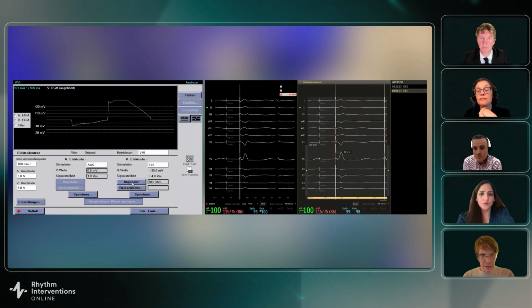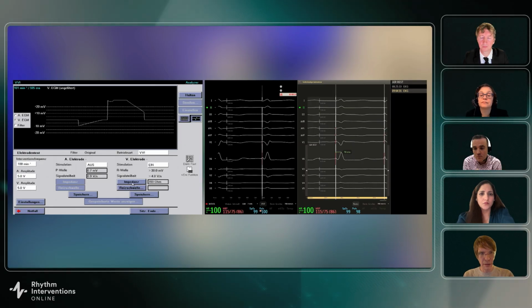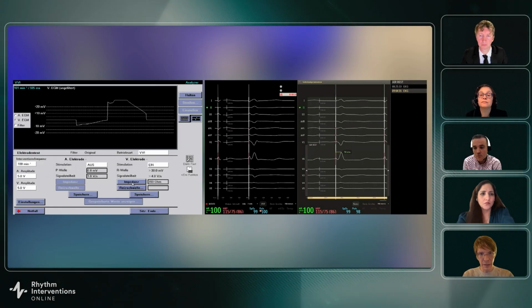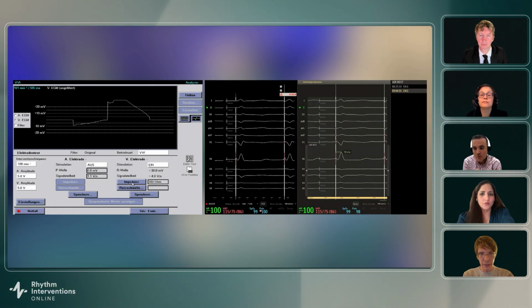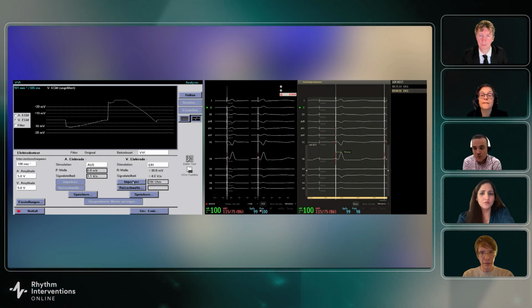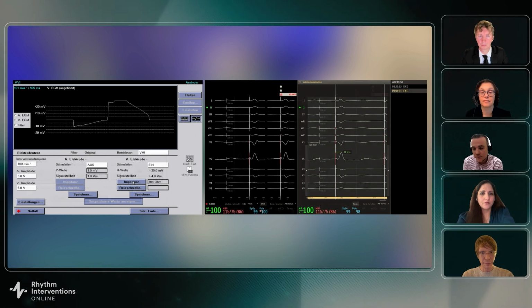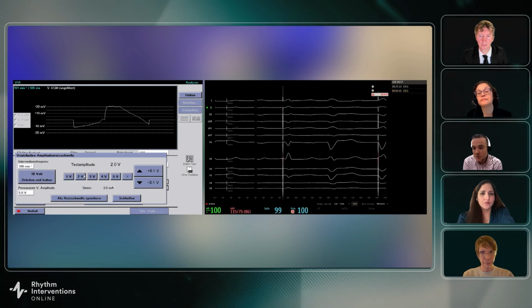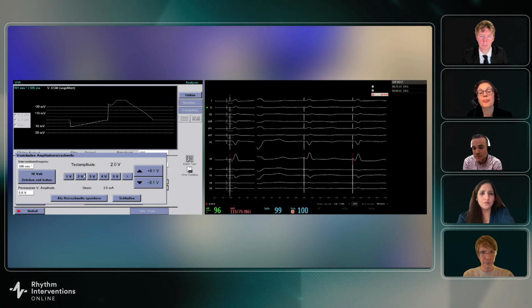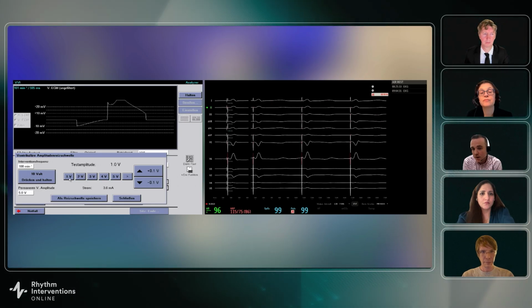So if I understand correctly, you measure the unfiltered signal on the PSA. You don't have it integrated in your EP tracer. No, we don't have an EP tracer. That's why we have only the 12 lead ECG. Understood. That's why I want to show how you can simply do it, because in so many centers we only have a 12 lead ECG, and that's why I want to show how we do it on these settings. So we measured the R wave peak time in V6.